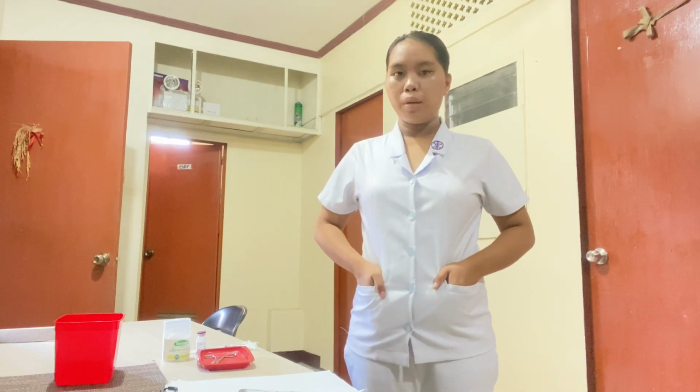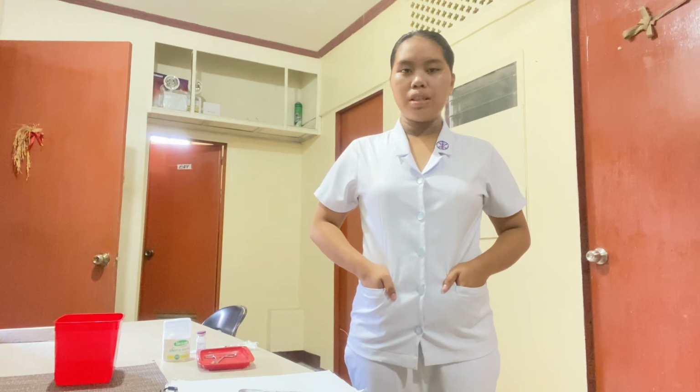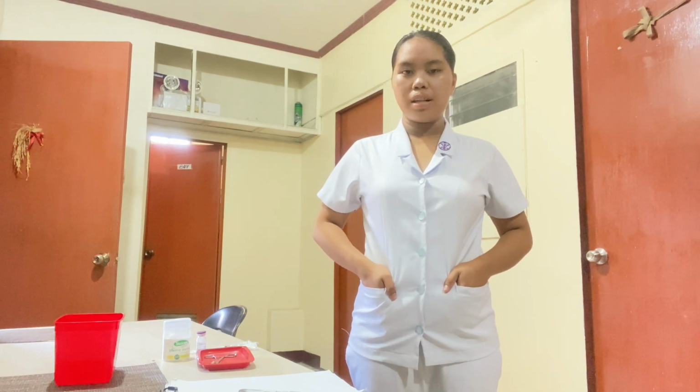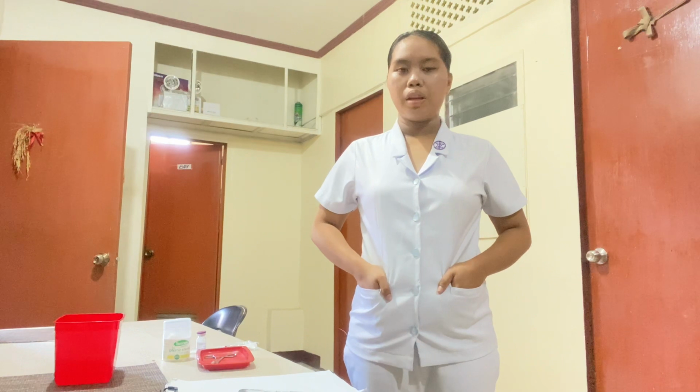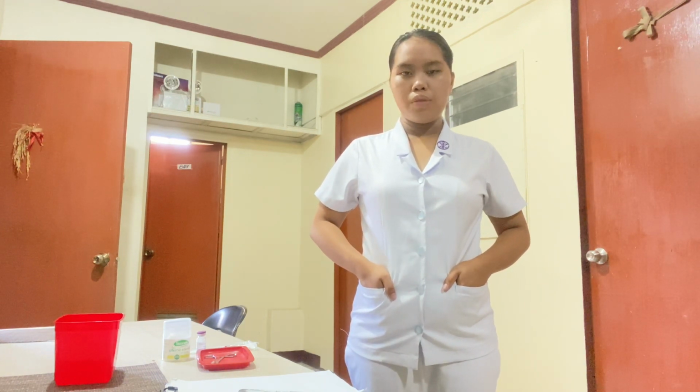Now I'm going to demonstrate first the intradermal injection. Intradermal injection is the administration of the drug into the dermis layer of the skin. First, I'm going to check the doctor's order to know what medication to give to the patient.